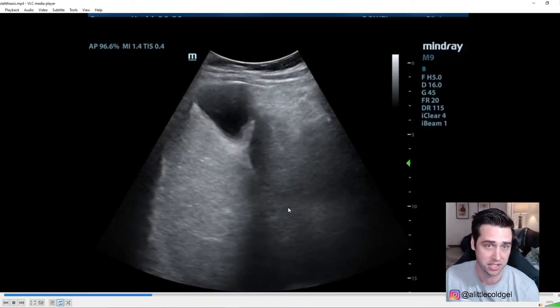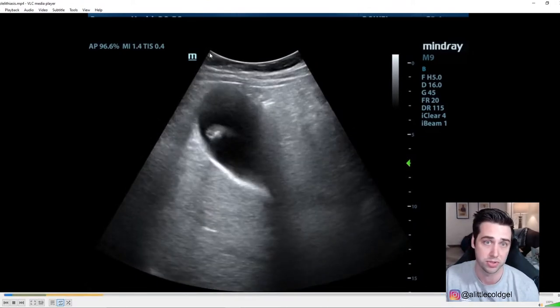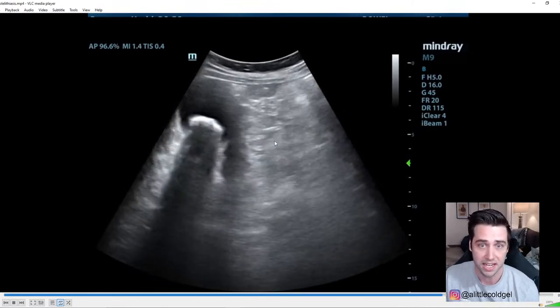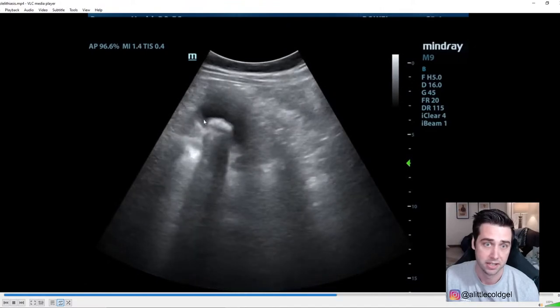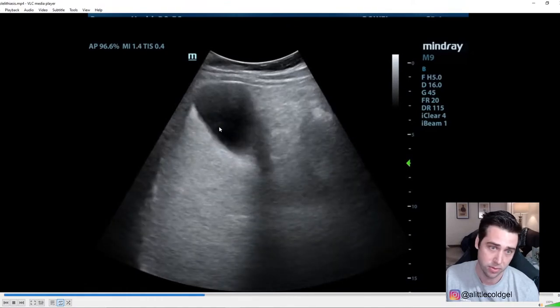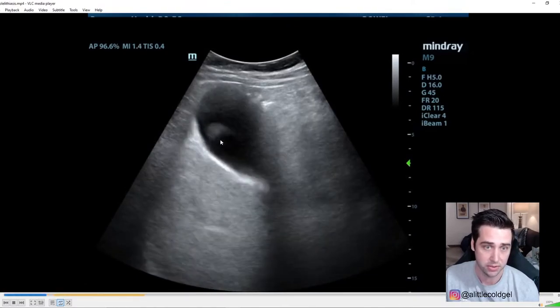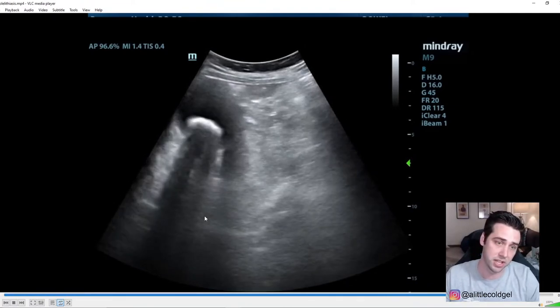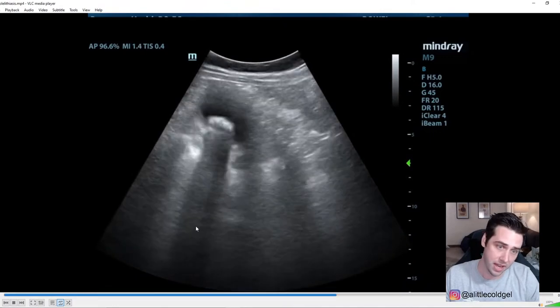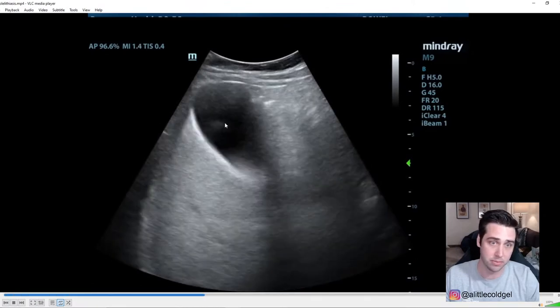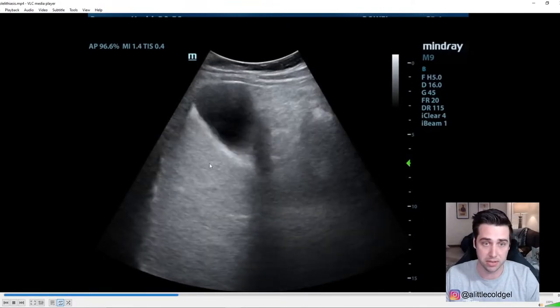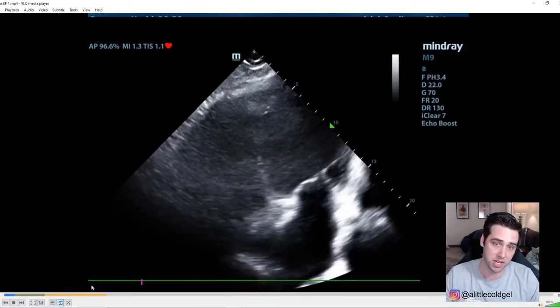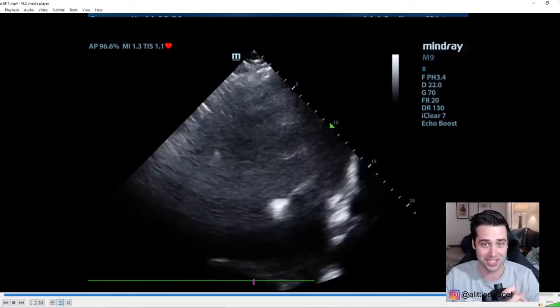This next image is also a gallbladder. Again, first things first — identify the probe: curvilinear probe. Soft tissue here, beginning of your peritoneum. This is actually a pathologic finding in the gallbladder. You see the anechoic sac representing the gallbladder, but this super bright white line is actually a stone. Whenever you have a stone you get a bunch of shadowing behind it, because the ultrasound waves can't travel through the stone. That shadowing is one of the key ways to identify a stone on ultrasound.